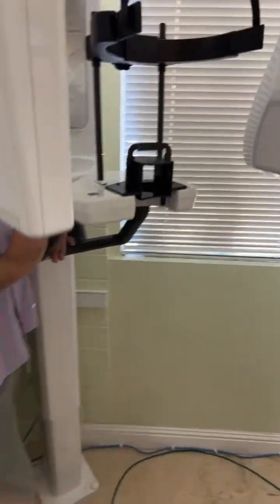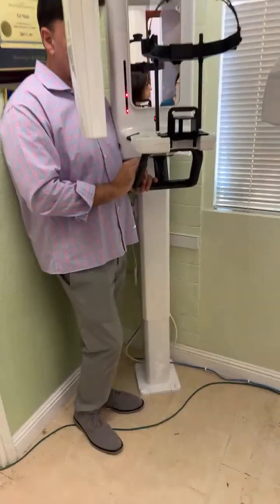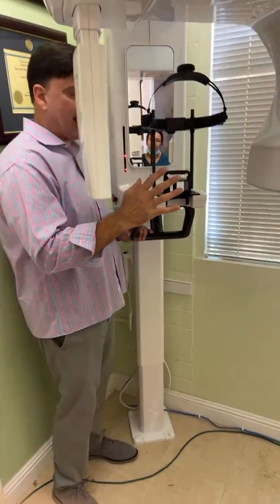So we have 3 options. All right. Okay. So now for this positioning of the head, it's pretty simple.